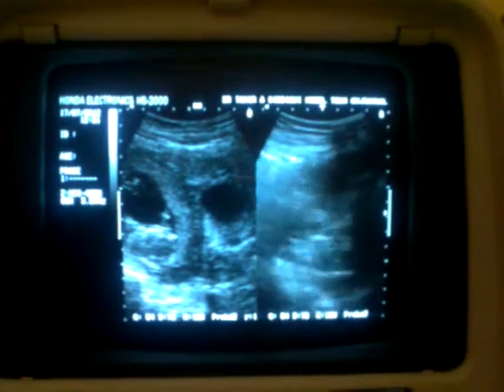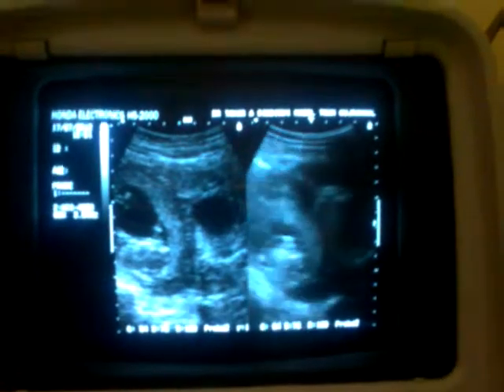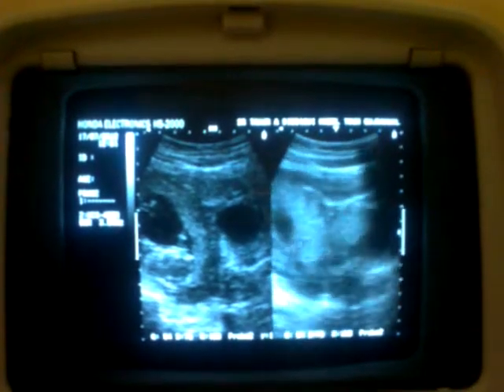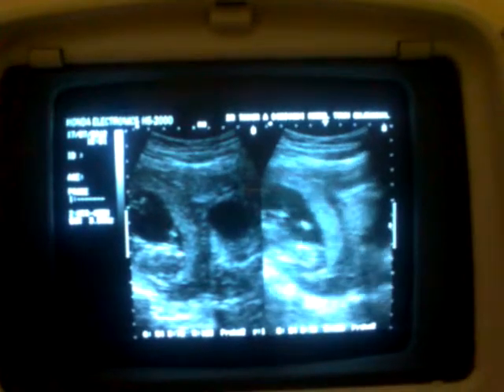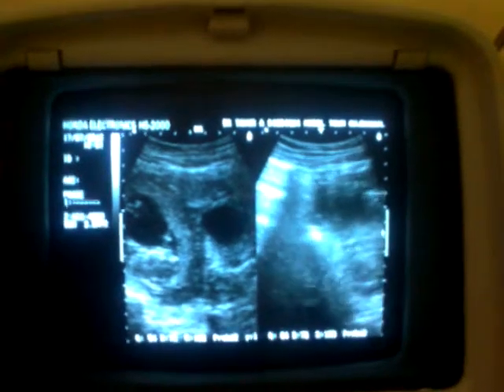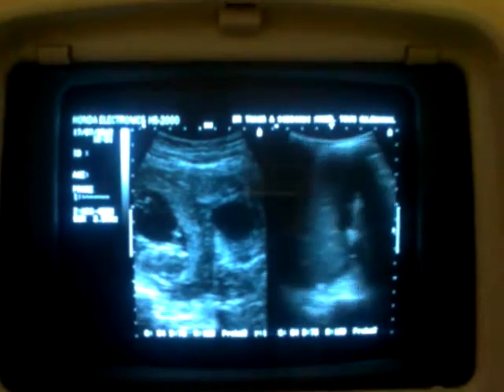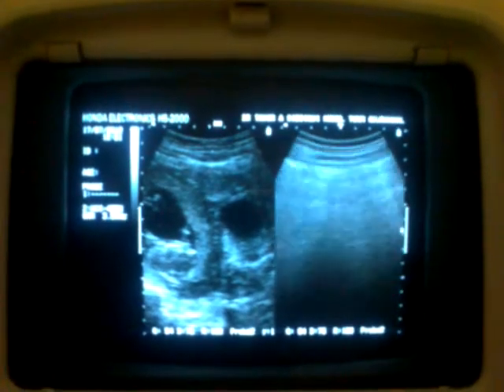here we are. Now you are seeing the fluid in the pelvic peritoneal cavity. These are the two intrauterine sacs, and here is the third sac, and the rest you saw was the fluid in the hepatorenal angle.